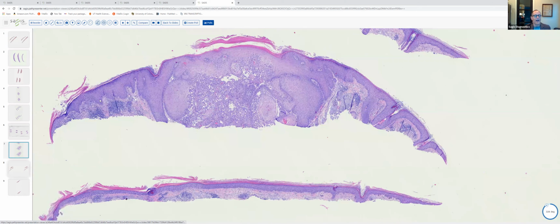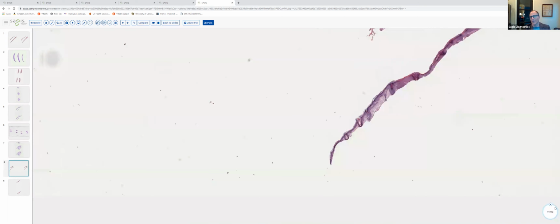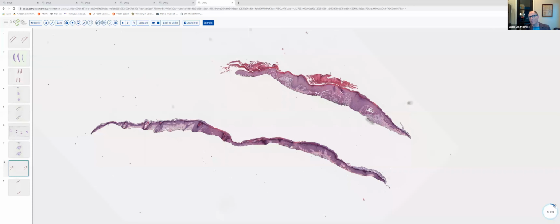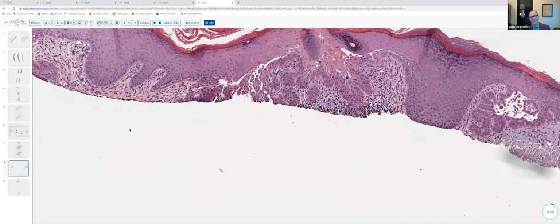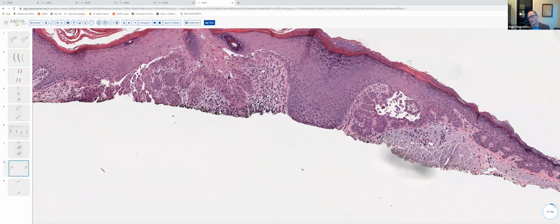Slides 8 and 9 bring up a very similar discussion. So let me tilt the slide here and move it over. In slide number 8, the correct diagnosis was an acantholytic AK. And you can almost make the argument here for superficial squamous cell carcinoma because there appear to be a few detached aggregates present near the base of the biopsy specimen. But again, severely sun-damaged skin, okay?